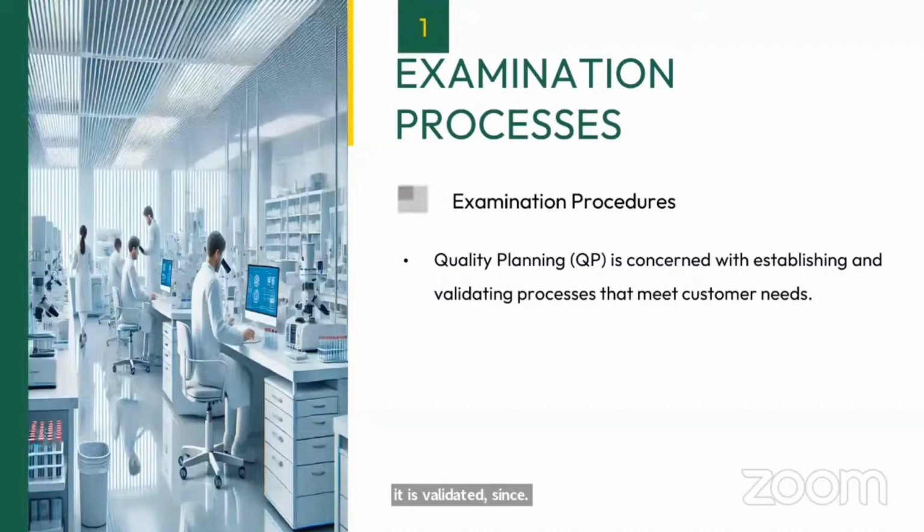But when I want to start this glucose estimation in my laboratory from XYZ manufacturer, what I need to do, the method is already developed. The kit is already available, commercially available. But now what I want to do, I want to start this test in my laboratory. So I will perform the verification because it is already a well known examination process, a well known test method, very common, everything is there. So I just need to verify those examination processes.